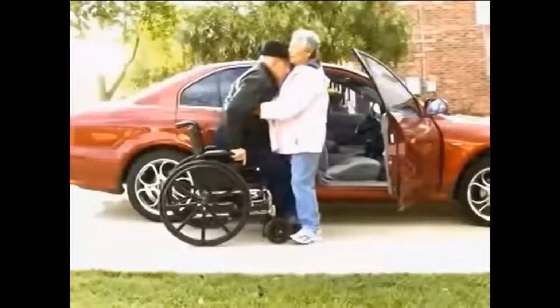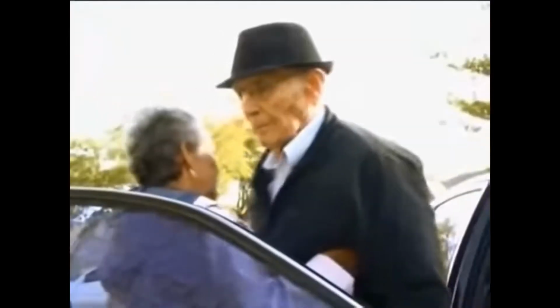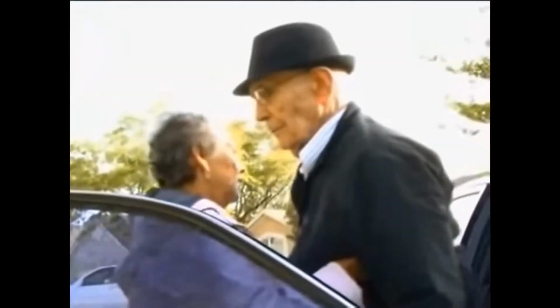If your loved one's legs are not strong, you can block their knees with your knees while they stand up. Guide the person to pivot and turn with small steps and back up to the car seat. Instruct your family member to bend their knees and slowly sit in the car seat. You should remind them to bend their head forward to avoid hitting their head on the frame of the car.